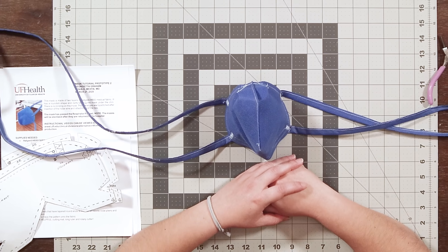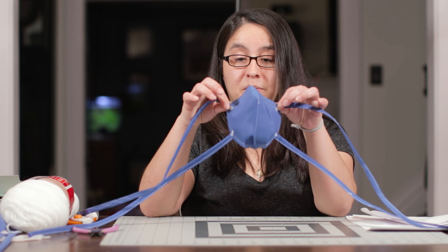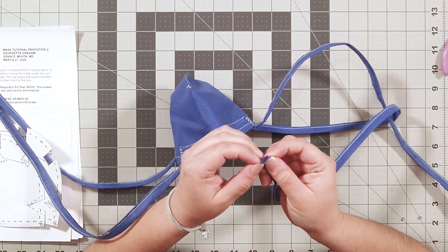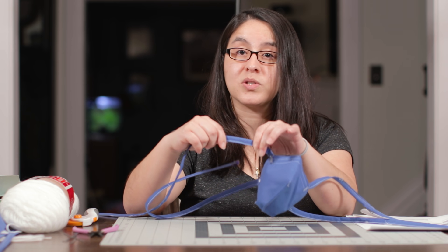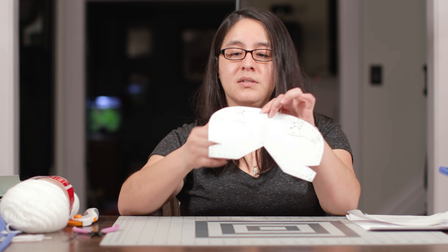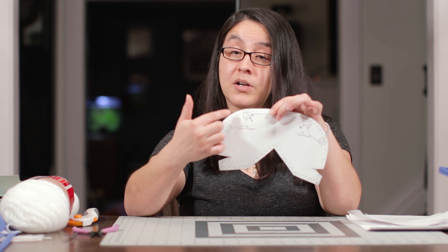I'd already made a surgical style mask, so I decided to try their second prototype which is this cup shape. There were a couple of improvements even in their surgical style mask — they reinforced their ties with yarn, which you can see peeking through here. That's because these are meant to be tight on the face, so the ties needed to be reinforced so they didn't snap when tied. The first thing I did was cut out the pattern provided. You'll see there is darting, and rectangles for tie placement, which I did not cut out on my initial pattern.